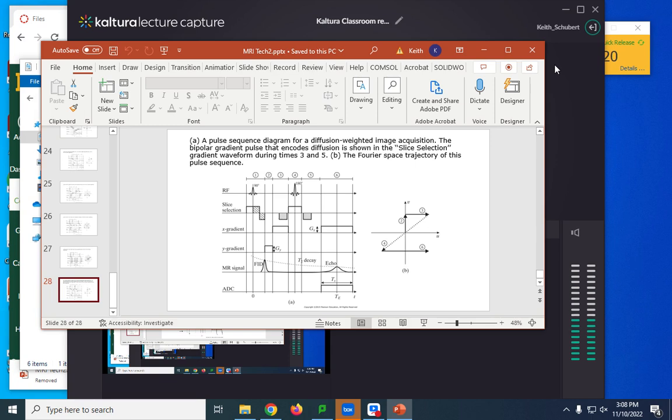Because if you do one direction, you do the other. So now your patient has to sit there 4 times as long. If a typical MRI scan is like 30, maybe 40 minutes, doubling the resolution means that poor person is sitting there for 2 hours basically. That's a little bit beyond what's practical. So it's really more of a time constraint that limits our resolution.